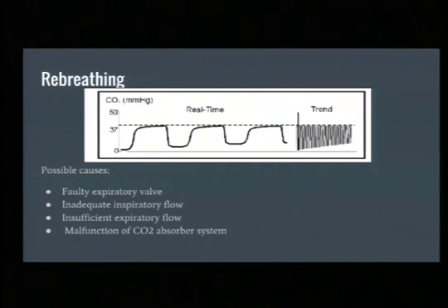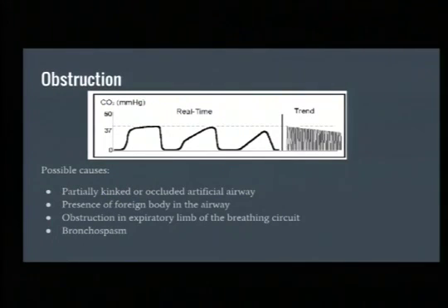So this is what you can start to see, and it'll get more pronounced with this baseline, this A to B on that previous slide, elevated more and more in a COPDer who's not being allowed to exhale enough, or not getting enough exhalation phase out. They stack up, and it's that auto-PEEP response. So this is that shark fin look.